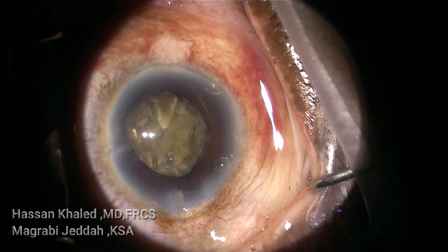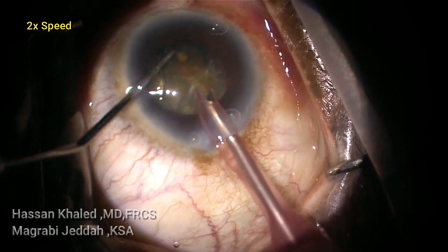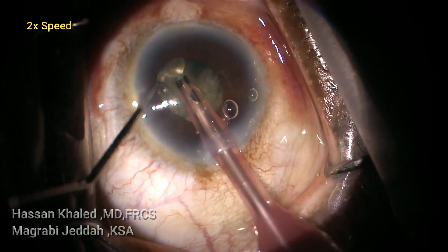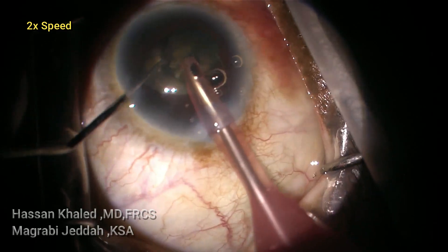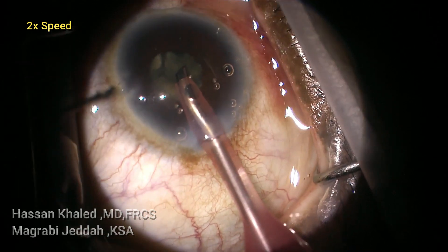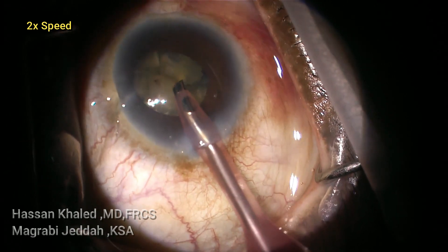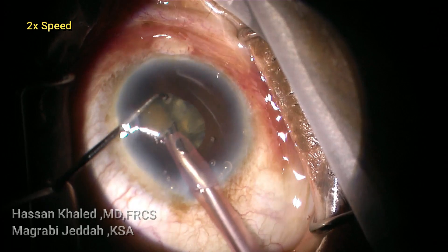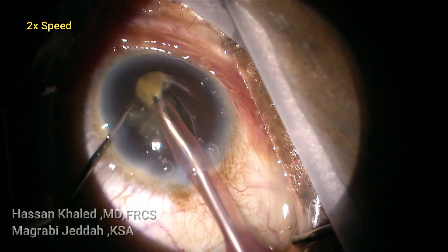Now you can see the pupil constricting, so I inject dispersive OVD to dilate the pupil. Then I change the sharp-pointed chopper into another chopper with a blunt tip and emulsify these smaller pieces. But the pupil constricts throughout the surgery. Here the second time I inject dispersive OVD to dilate the pupil, then rotate the nucleus trying to emulsify these smaller pieces.